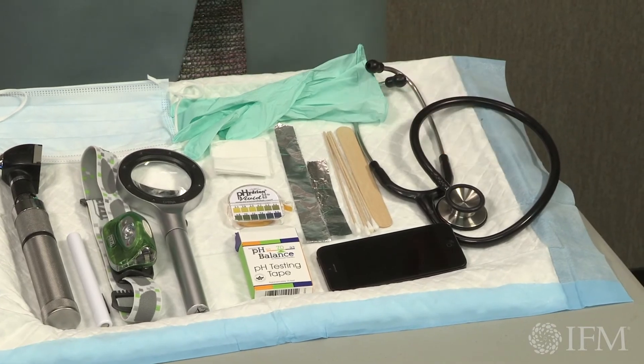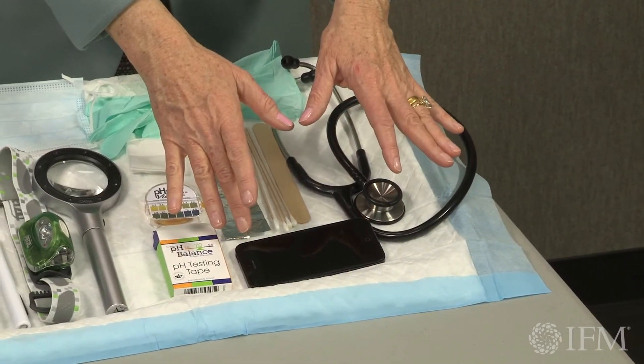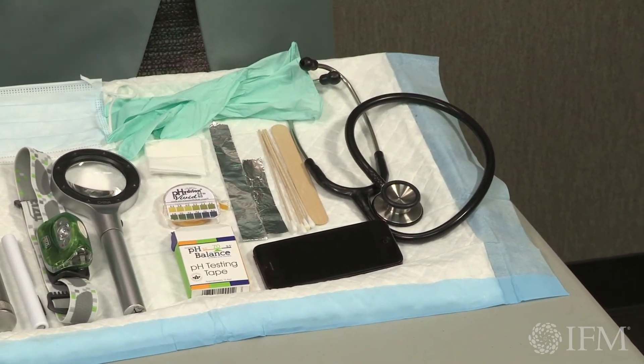The stethoscope is helpful for when you palpate and listen to temporomandibular joint sounds. And finally, we have a camera in the operatory to photograph and document any lesions or anything that we might find. That's the equipment you need for your functional dental exam.